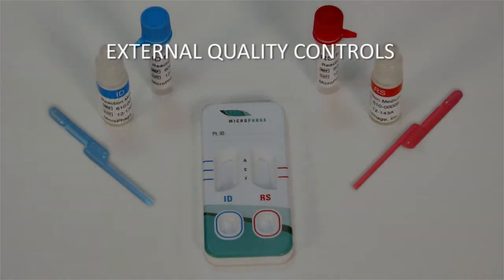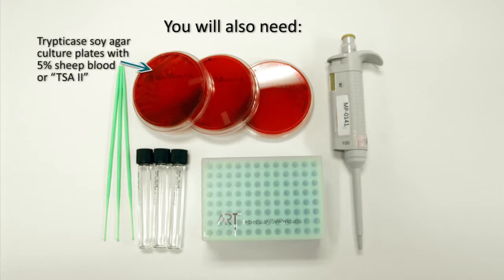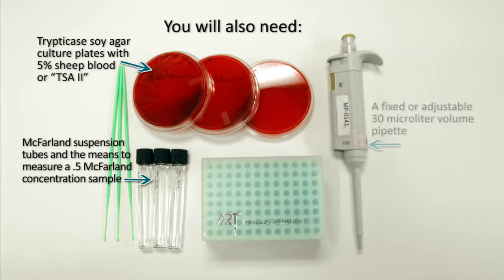To perform the external control procedure, you will need the following materials in addition to the materials discussed earlier for performing a patient sample. Trypticase soy agar culture plates with 5% sheep blood or TSA-2, McFarland suspension tubes, and the means to measure a 0.5 McFarland concentration sample, and a fixed or adjustable 30 microliter volume pipette.